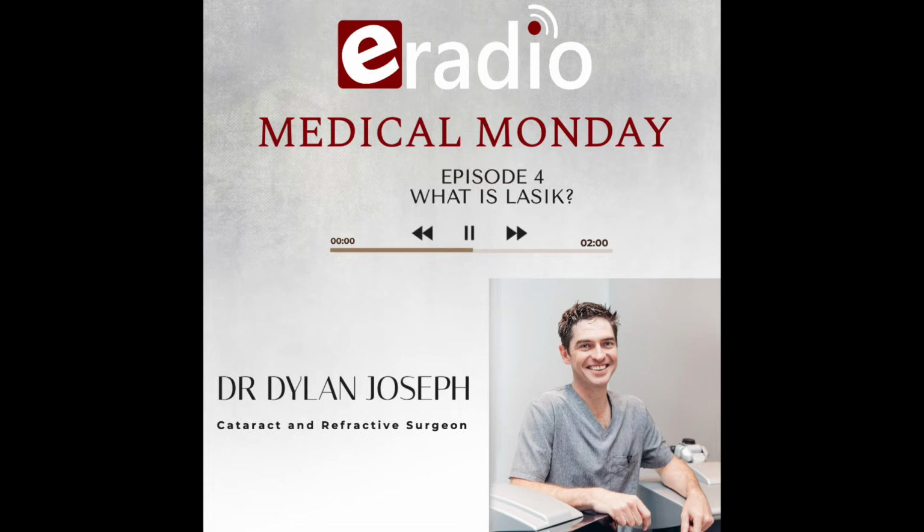So what these new lasers do is they incorporate into the laser profile what we refer to as a transition zone. This transition zone helps increase the diameter of the optical zone, the zone through which we're going to be seeing, and it essentially creates a zone that's larger than your pupil. So your quality of vision during daytime and during the nighttime is a lot better.